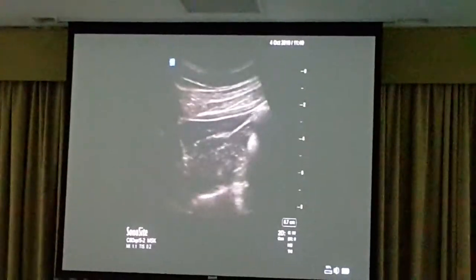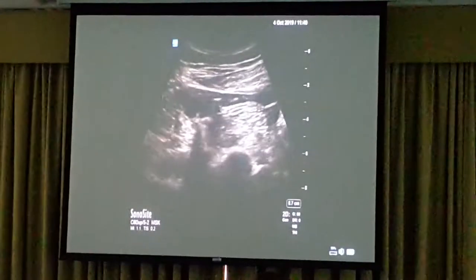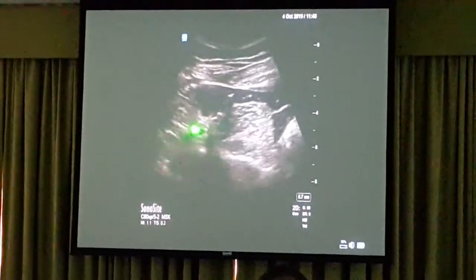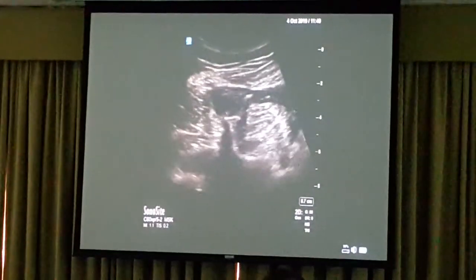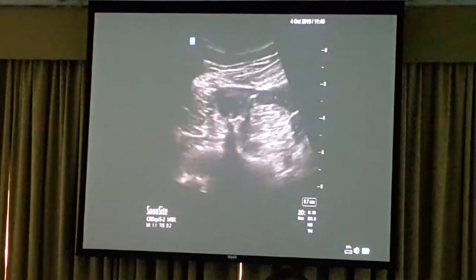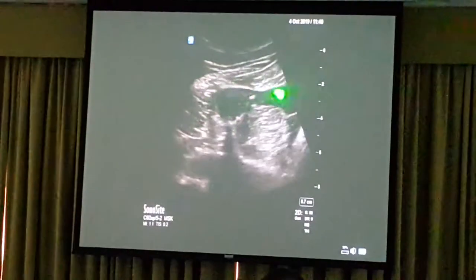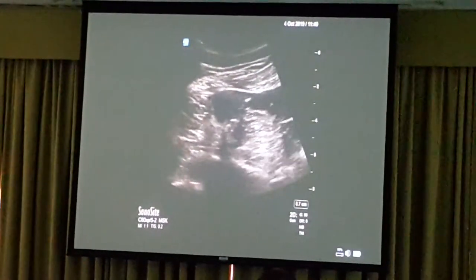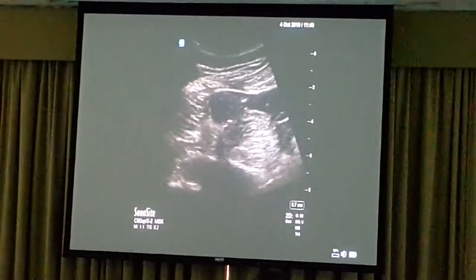You can see the same muscles as before. In here there's a shadow in the middle pointing to a dark muscle. That shadow is the transverse process of the vertebral body, straight in the middle, pointing to the dark muscle. The darkest muscle you will see is QL — whenever you see a dark muscle, it's the QL. QL is never white; it's black.